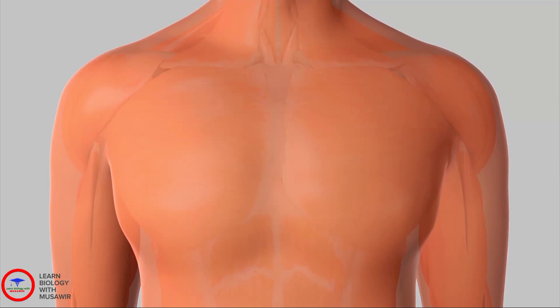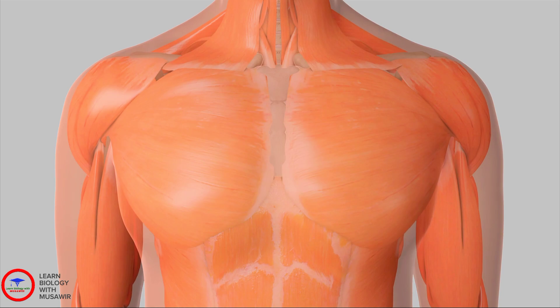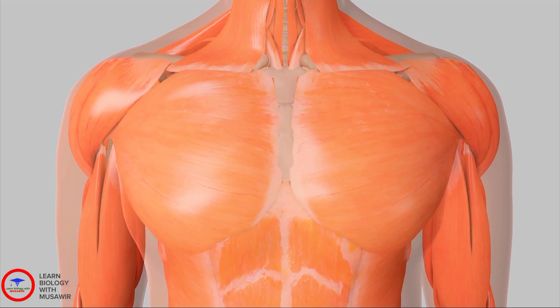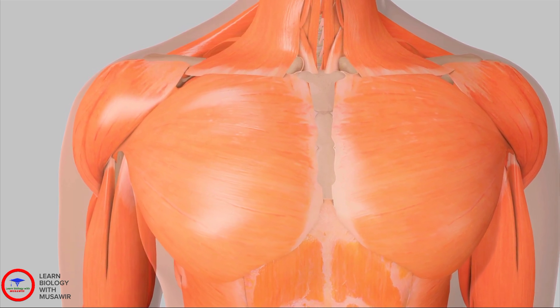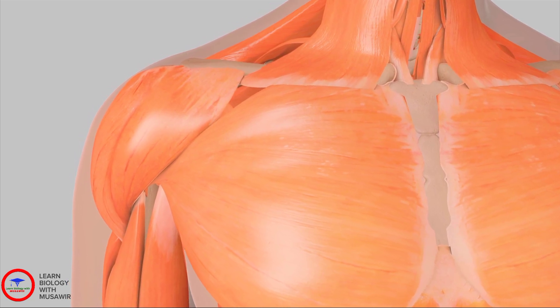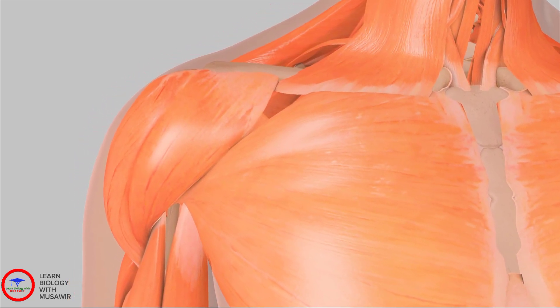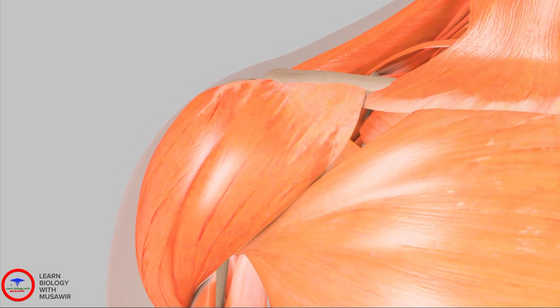The shoulder, a ball-and-socket joint, is the most mobile joint in the body. Because the shoulder is stabilized by muscles and tendons rather than by bone, it has a wide range of motion. However, this great degree of motion has a trade-off. The stability of the shoulder is dependent upon the surrounding soft tissue and can result in a number of problems not faced by other joints supported by bony structures.